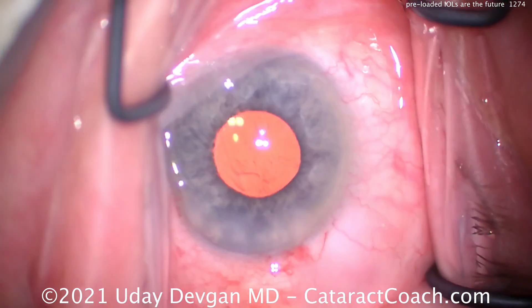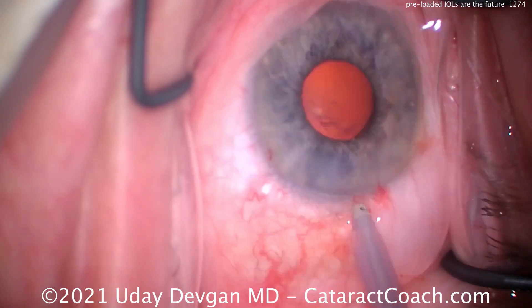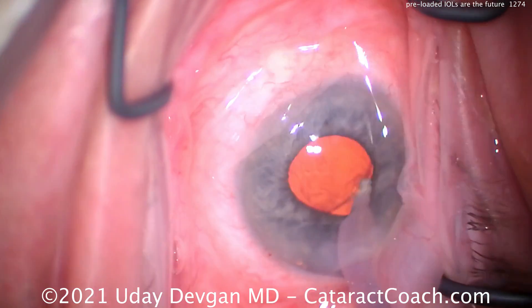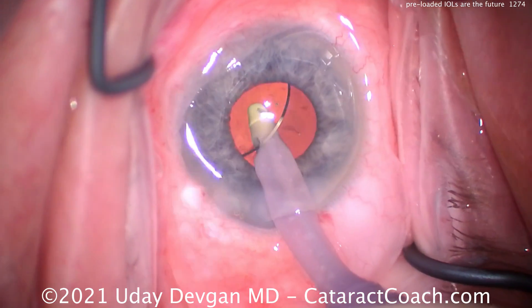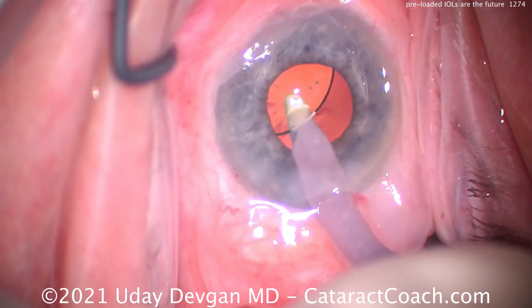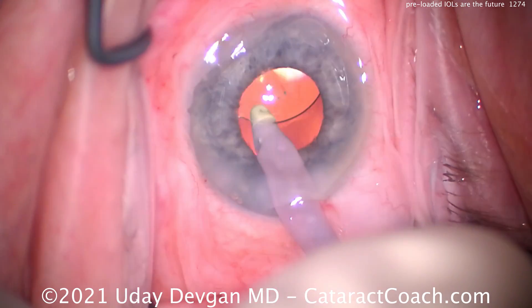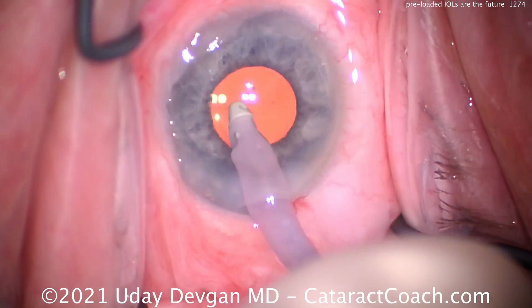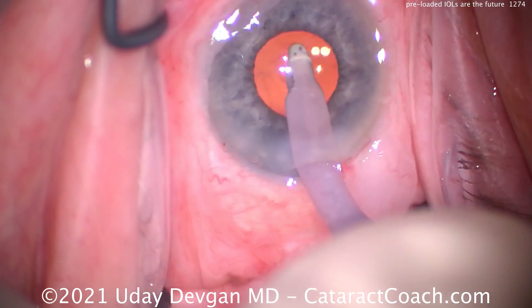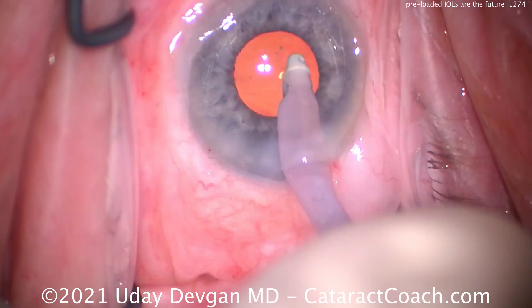I do wish the manufacturer would give us the secret code to the model names they're choosing, because they're not exactly intuitive in a lot of cases. We can guess at it and we memorize these five or six digit names, but it would be very helpful if they clued us in — or maybe consulted some ophthalmologists in choosing the next model name, instead of having engineers who don't have to memorize these crazy names like we do.